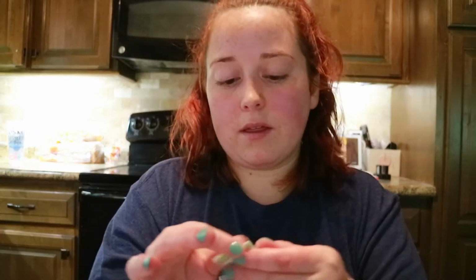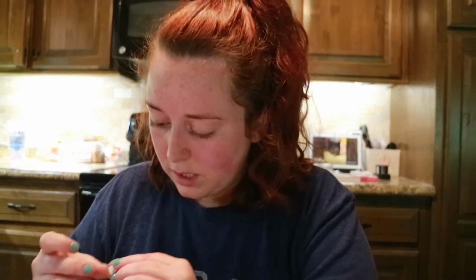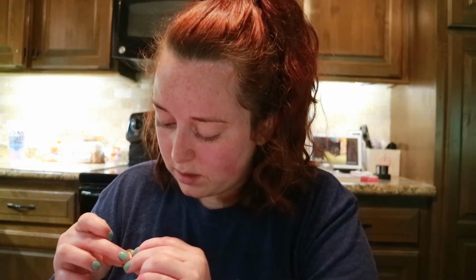Okay, so it's wanting me then to basically take off the tourniquet. Okay, apply pressure for up to 10 seconds and wipe excess blood with an alcohol wipe, and then get the Band-Aid out. And this part doesn't really need to be sanitary, I guess, for lack of better words, because you've already taken the blood sample. You just didn't want the blood sample to get contaminated.